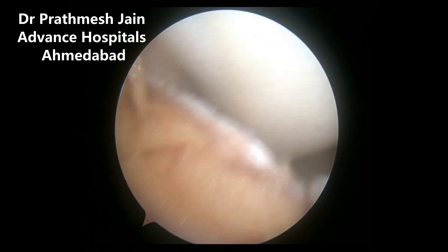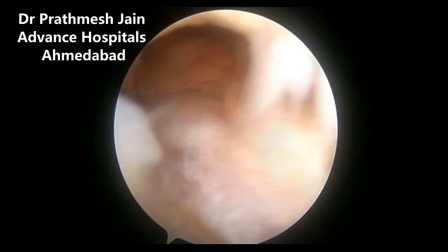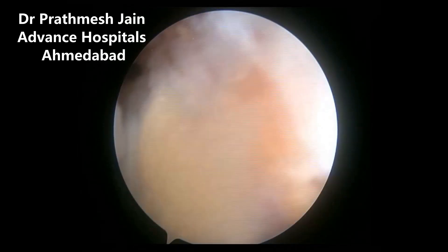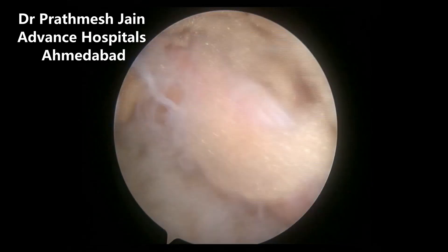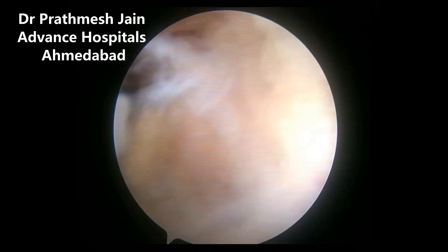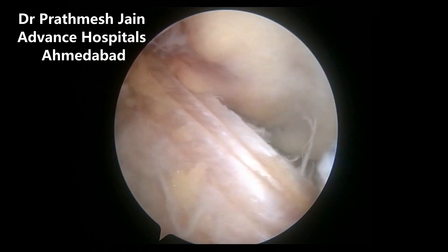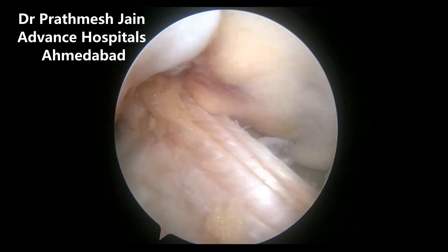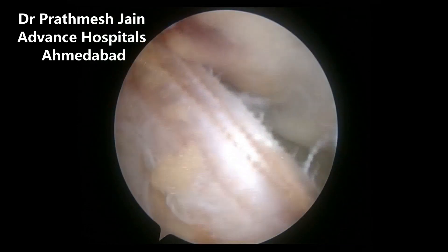Here you can see that the fascia lata autograft is a very good graft in which we can avoid drilling and passing any screw or anything through the physis. Thereby, the chances of growth disturbances in this particular case is nearly zero. Here you can see a very nice ITB autograft which is functioning like an ACL very nicely.